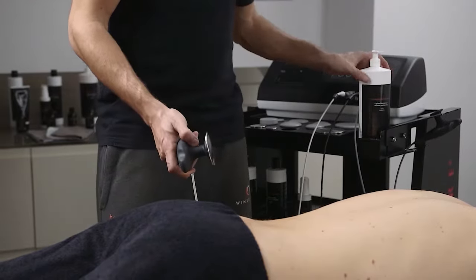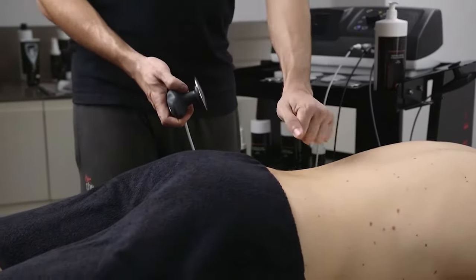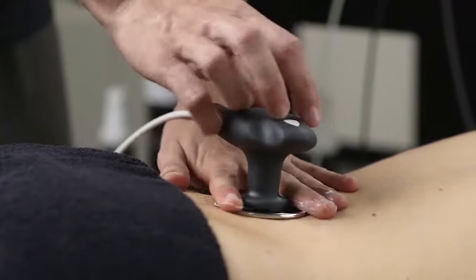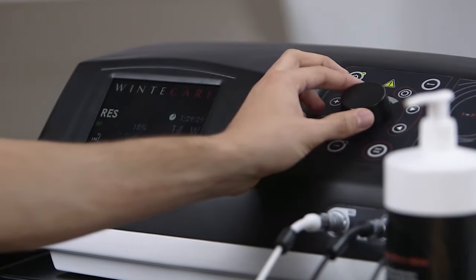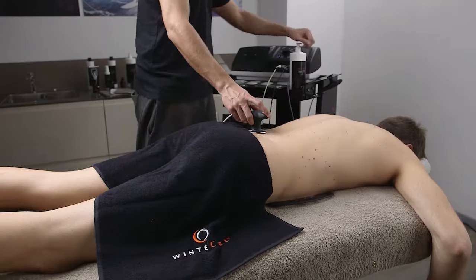Unlike other equipment in the same category, T Plus gives the operator the possibility of transferring extremely modelable quantities of energy in a measurable, precise and safe way. It is therefore the ideal tool for many fields of physiotherapy, sport and body conditioning.